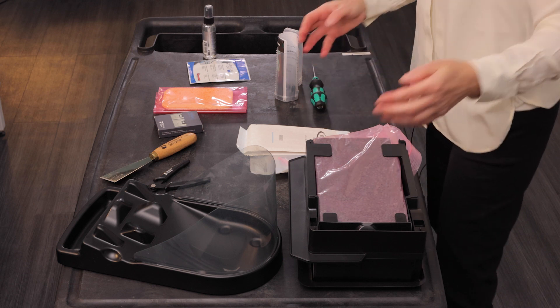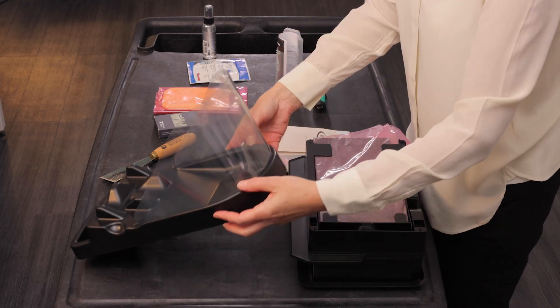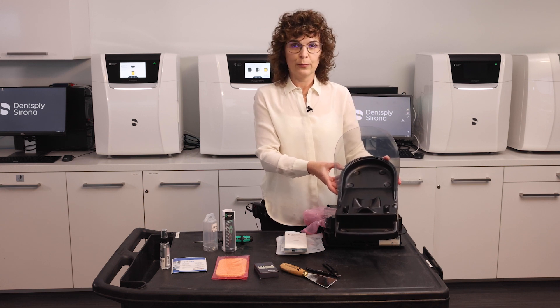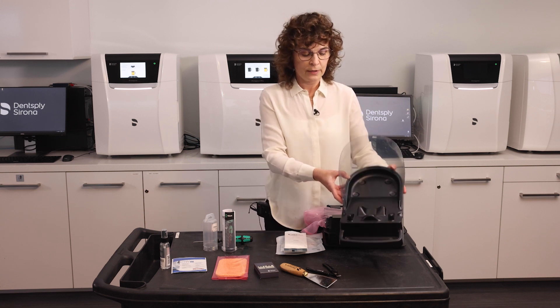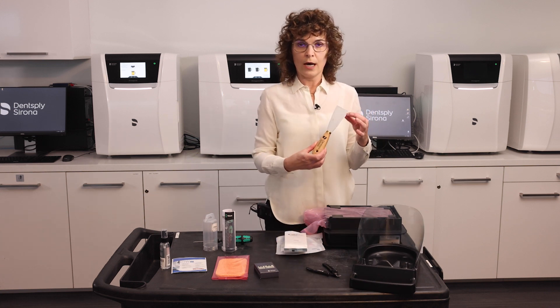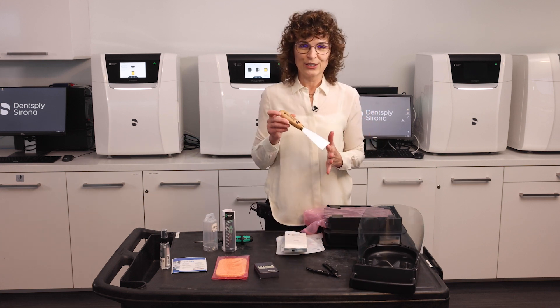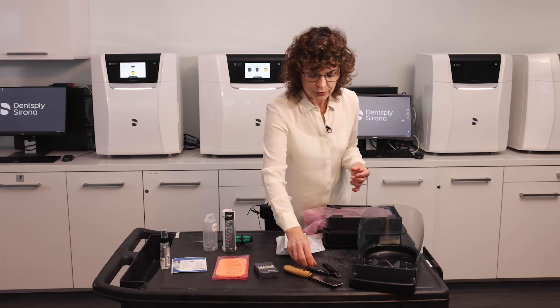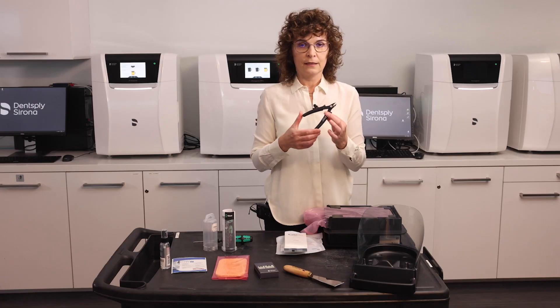Additionally, your Prime Print solution comes with a platform holder that aids in removing prints from the building platform. You are also going to use a spatula with the logo up so that the bevel is positioned correctly to gently loosen up and remove the prints. To remove the supports, you will use this side cutter.